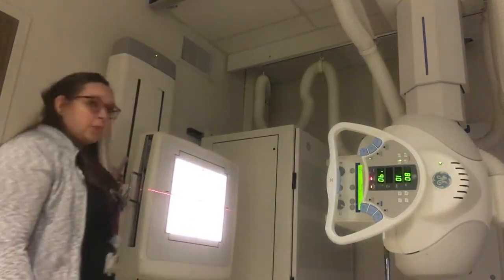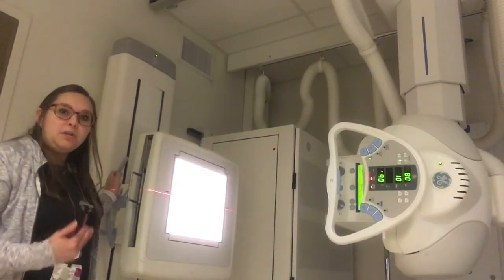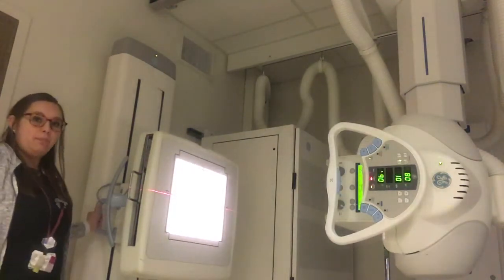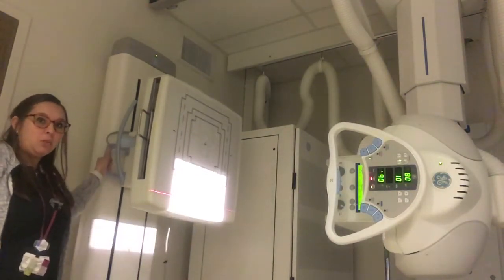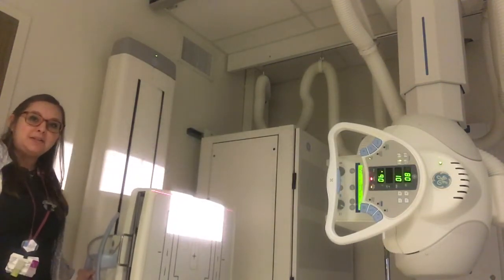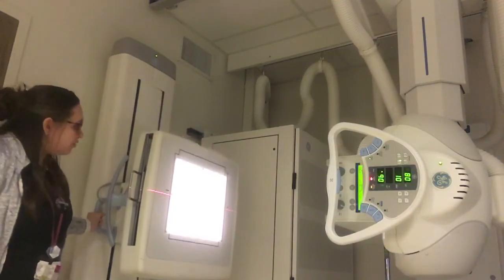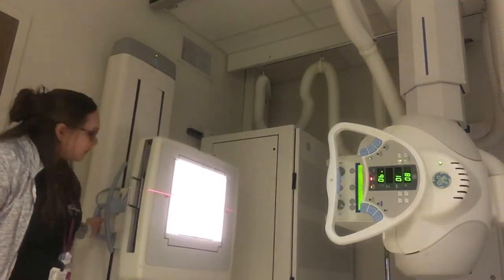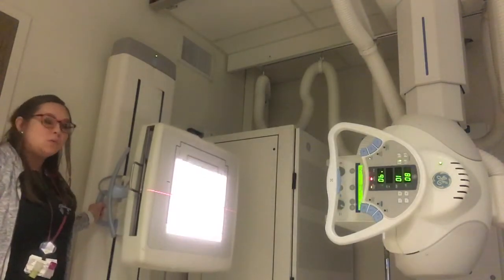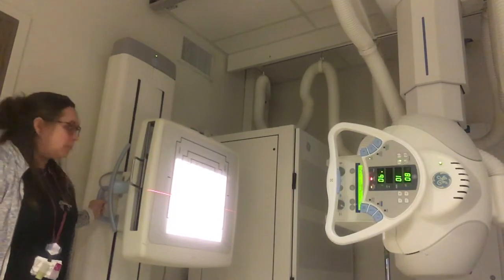We need to be able to raise and lower our buckies, because each patient is not the same height, so we need to adjust for each patient. There are handles on the upright bucky here to raise and lower it. If you notice, the collimation light stays right where it is — these two don't track together, so we need to make sure they're lined up. If I adjust my bucky, I need to adjust my tube as well. My pretend patient is just a little bit taller than me.